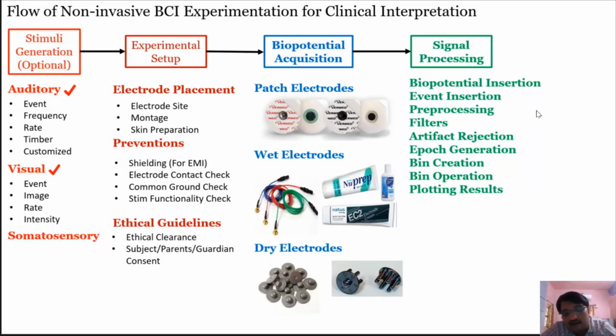If you have come across any kind of EEG recording, even a small movement of yours can clearly disturb your EEG. If a person is moving, you can see it in your EEG. If a person blinks, you can see that shape in the EEG. If a person is swallowing something or moving his eyes, you can easily see this in your EEG.